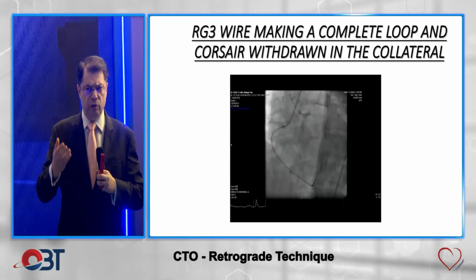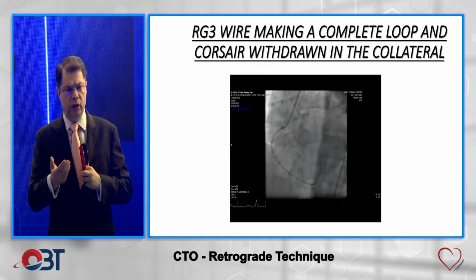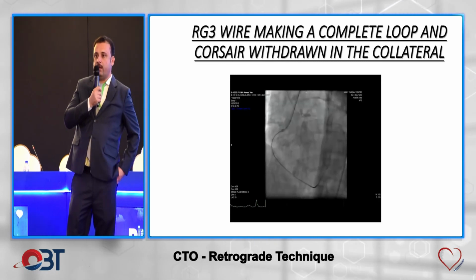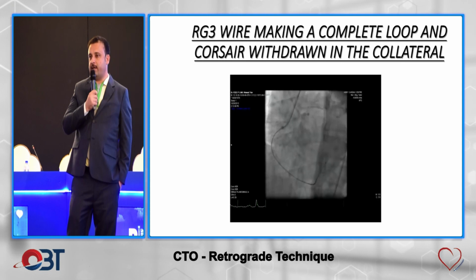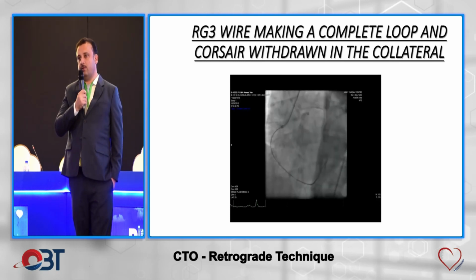And what are interventional collaterals? Those in which you are confident that you can gain access from the retrograde approach into the antegrade. Other than ostial flush occlusions, in any ambiguous cap occlusions, we should initially attempt the antegrade, because sometimes you are lucky and you find a path and can go antegrade.